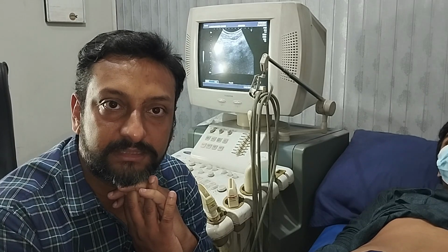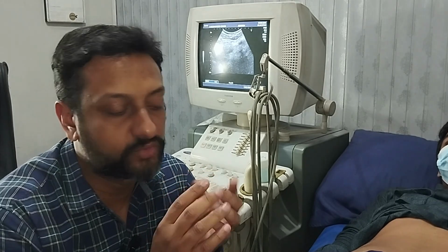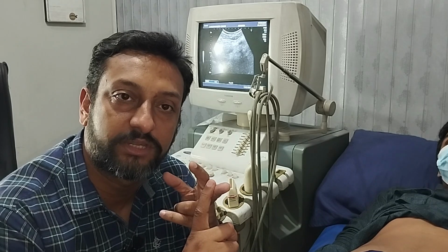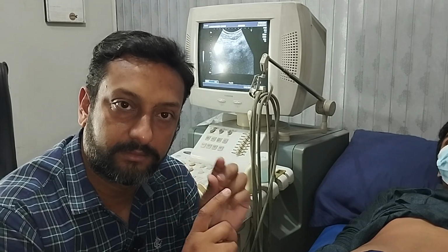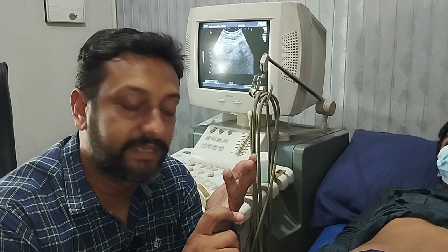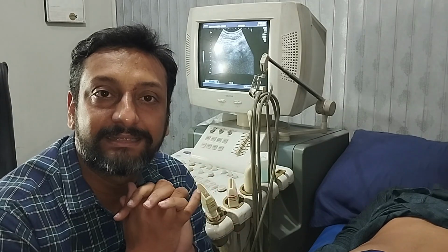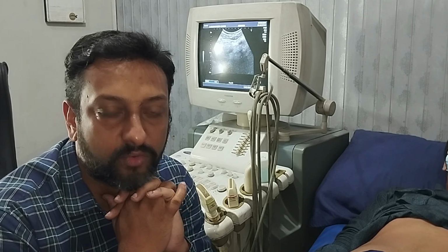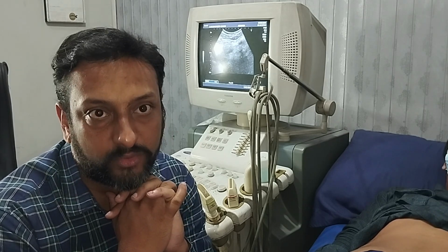And if the pancreas measurement is 2 by 2 by 2 centimeter, meaning the head is 2 centimeter wide, the body is 2 centimeter in depth, and the tail is also 2 centimeter. If the size is less than 2 centimeter, think about a chronic etiology. And if the size is more than 2 centimeter, then think about an acute etiology.